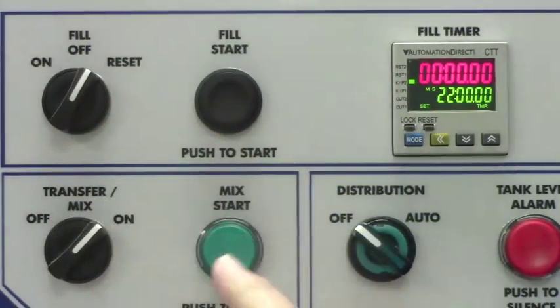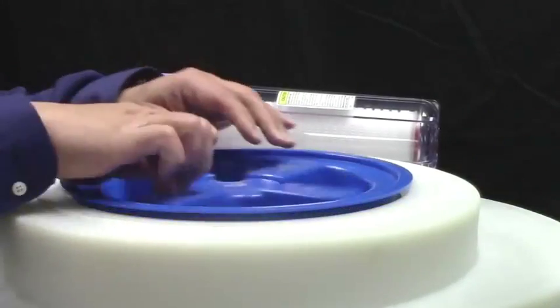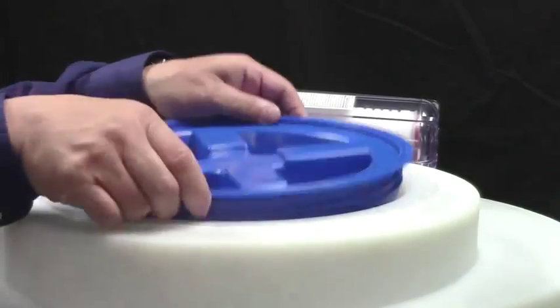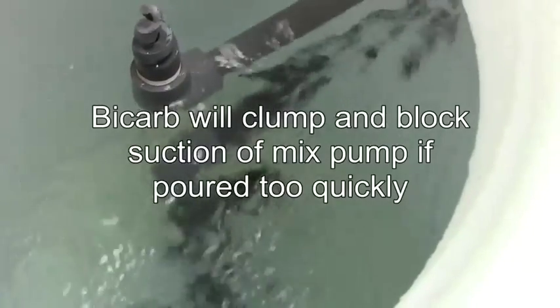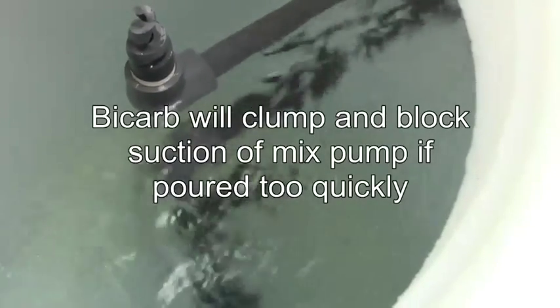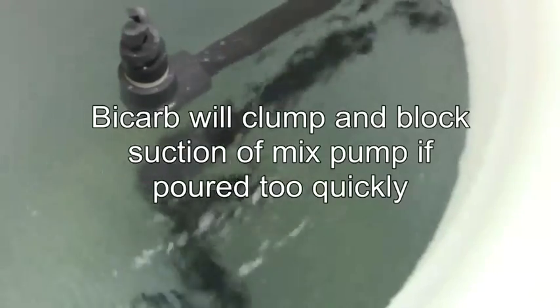Turn the transfer mix switch on and push the mix start button. Remove the mix tank lid. While the water is agitating, slowly add bicarbonate powder. Be careful not to pour it too quickly, in order to prevent bicarb from clumping, which will result in blocking the suction of the mix pump.